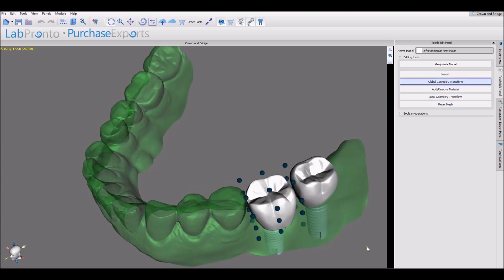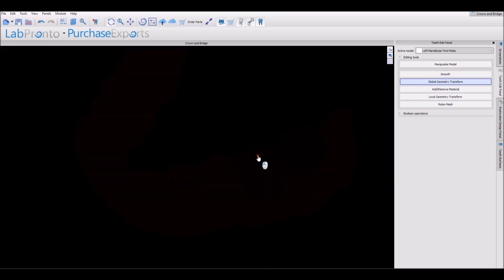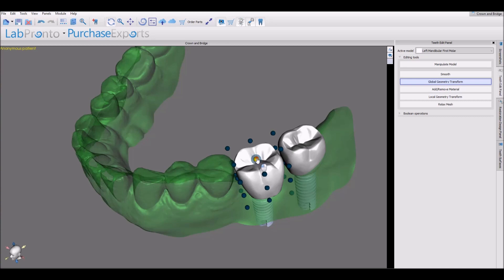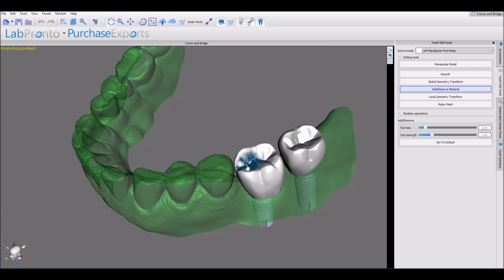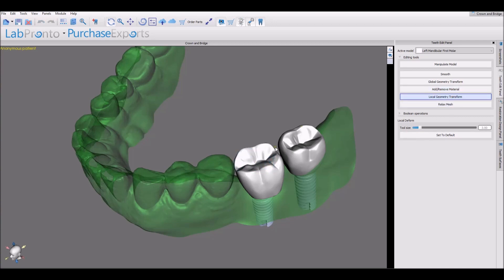Global Geometry Transform: you can grab any of the nodes to stretch and transform the tooth. Hold down the Shift key to add material using the left mouse button, and Control plus left mouse button removes material. Local Geometry Transform: you can grab any spot on the tooth and drag it to design the tooth accordingly. You can control the tool size using the slider.